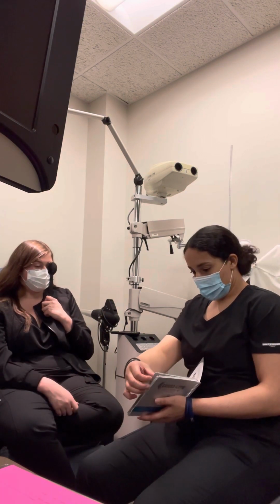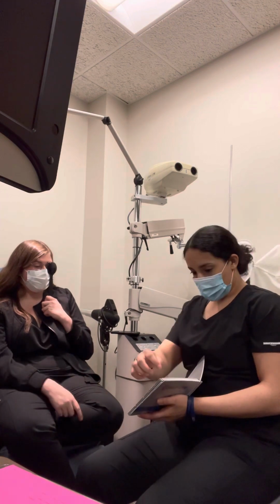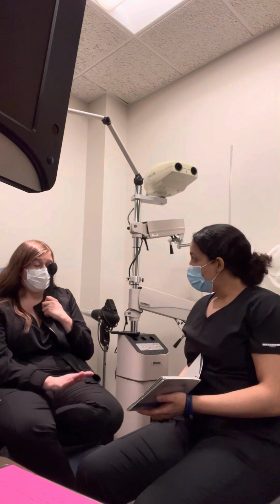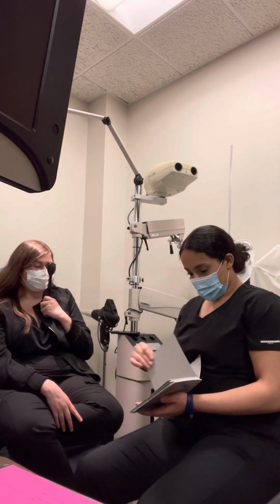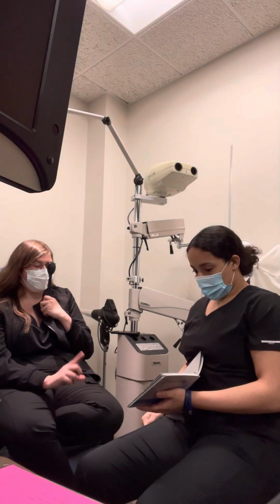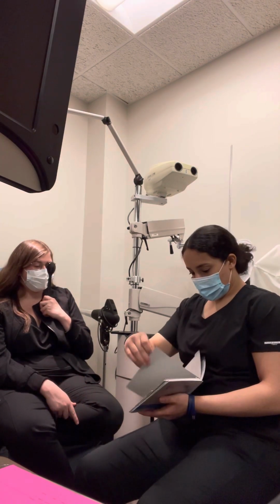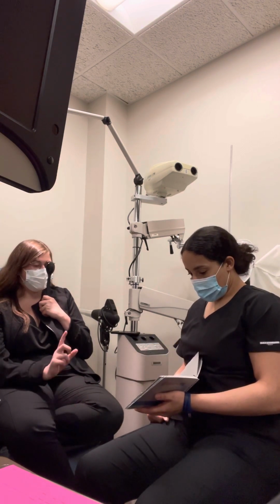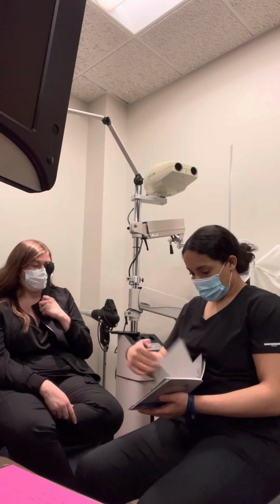O, X. Oh, goodness, okay. X, triangle. Those are fast constrictions, so 4 plus. Nothing. Okay, just go ahead and make sure it's covering up for me. Thank you. Okay. O, X. Last thing, I'm gonna do one last test to see. O, triangle. X, triangle. Triangle, O. Alright, I'm gonna have you look at where that is.